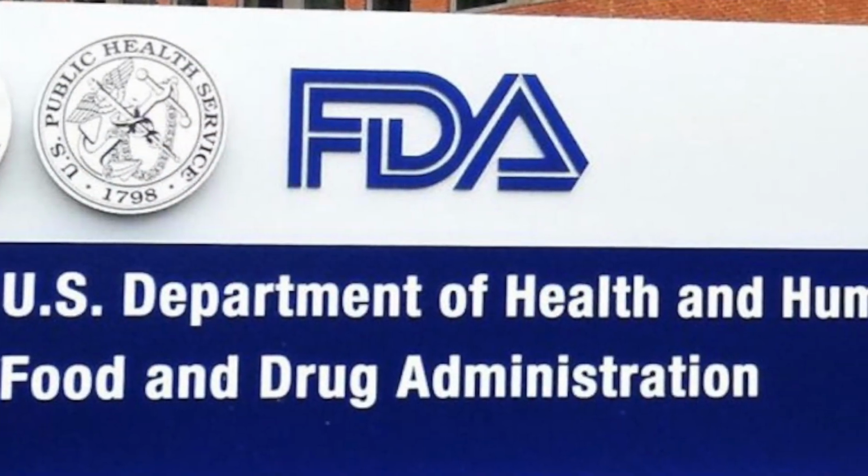Imagine these numbers. In 2019, the US Food and Drug Administration, FDA, released 2 decades of previously unpublished data, including 2.1 million reports of failed dental implants and more than 100,000 of which refer to 2018 alone. Most of these failures related to a lack of osseointegration. You know better than me that the number of additional unreported losses is likely to be much higher. And maybe this is just the tip of the iceberg.